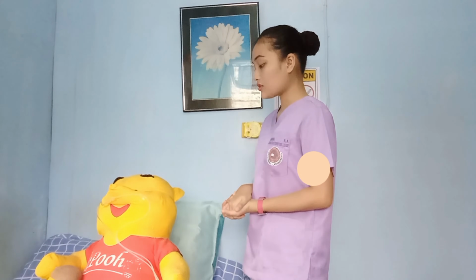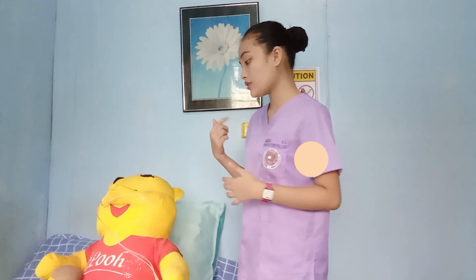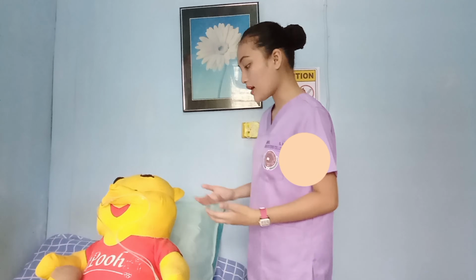So looking at my client, I don't see any signs of incrustations or irritations. Next is to apply a water-soluble lubricant as required to soothe the membranes of the patient. So here I have a nasal lubricant. This is for you. We need to apply this to your nasal area so that we can maintain its moisture and avoid irritation and drying. Is it okay?